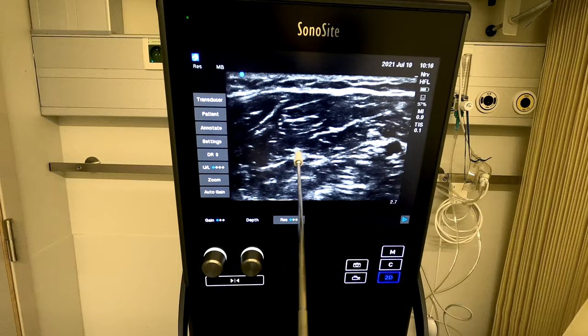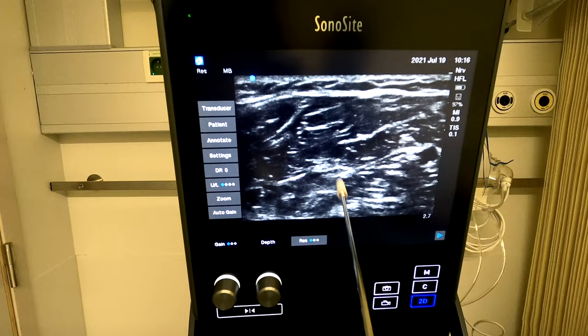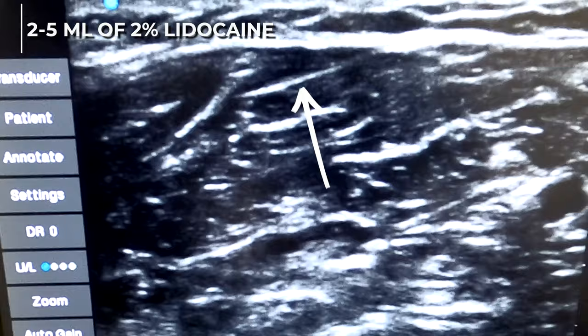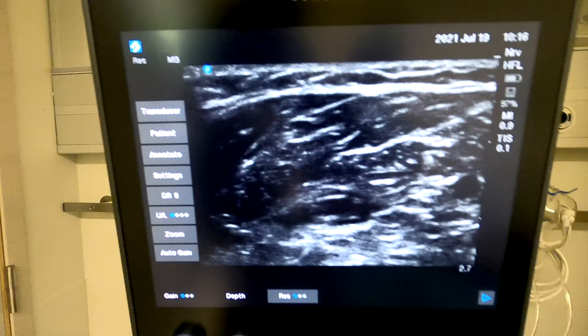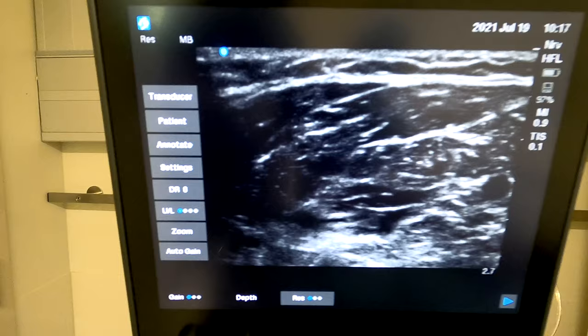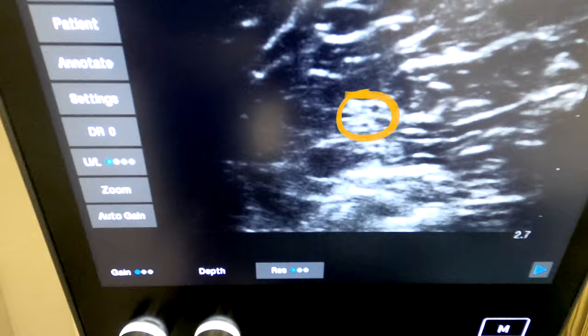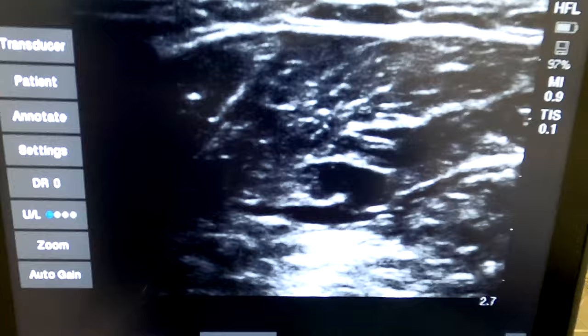Advance through that fascial sheet. Pull back slightly and slack off the pressure — that is very important. With less pressure we see a very nice spread. Now, refocusing, you can see a nice distribution of local anesthetic around the median nerve. Aspiration negative — that's what you want. So we're done with the median nerve block.